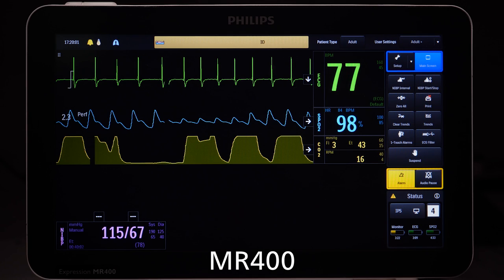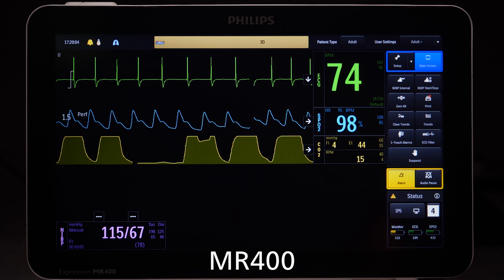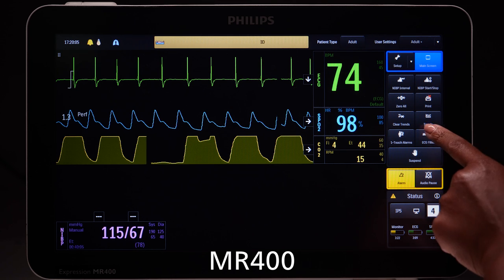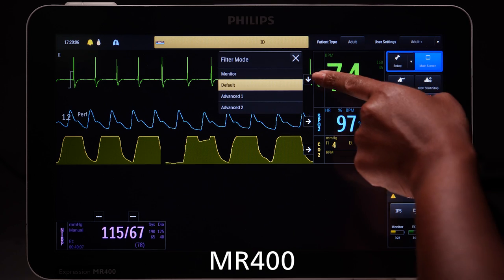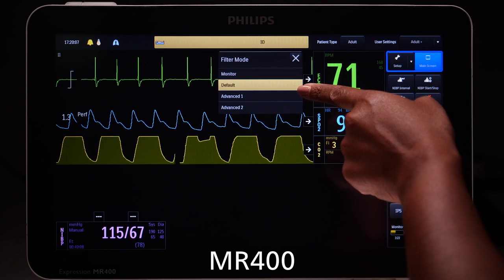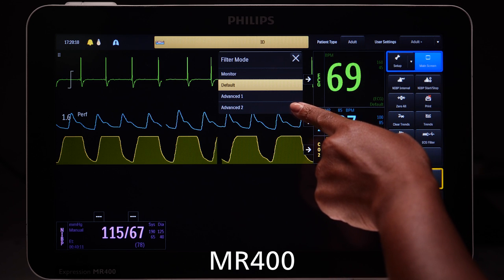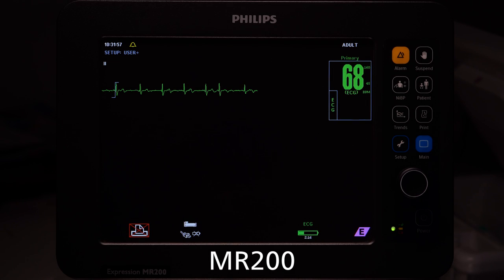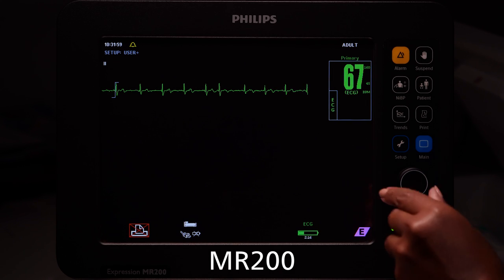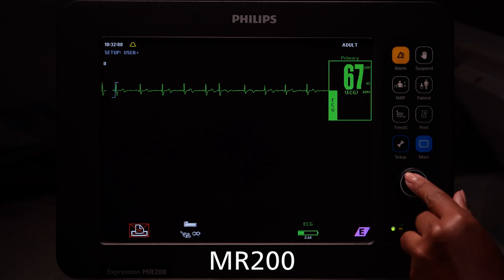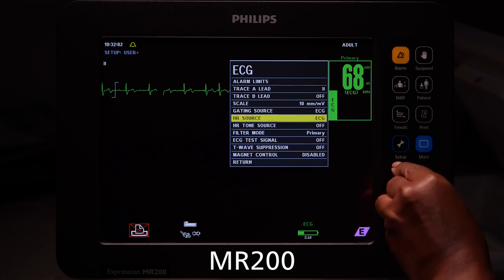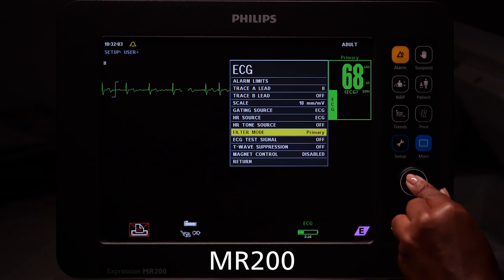As mentioned in the ECG training video on the MR400, Advance 1 filter is the recommended filter for cardiac gating, followed by Advance 2 filter. On the MR200, cardiac filter in Lead 2 is the recommended filter, followed by Advance filter.